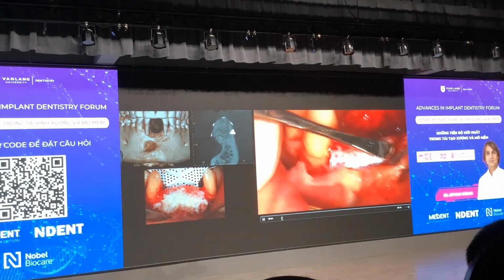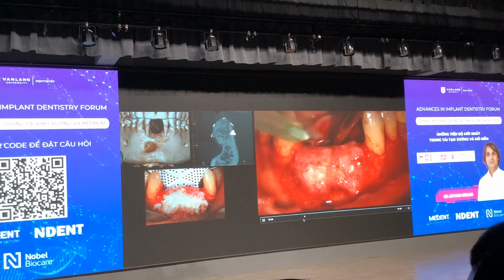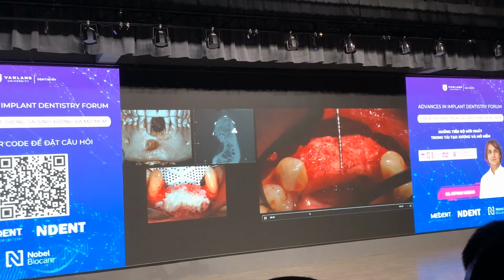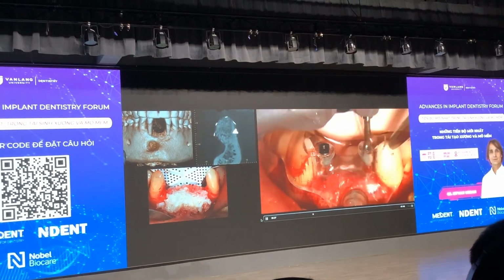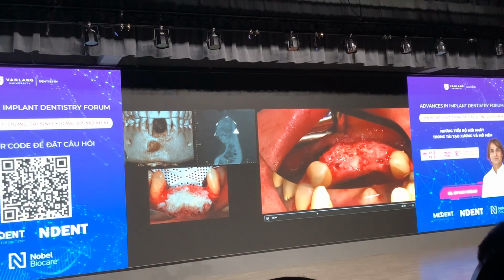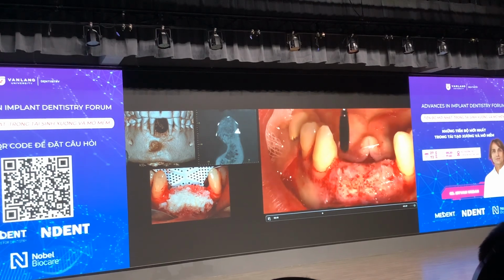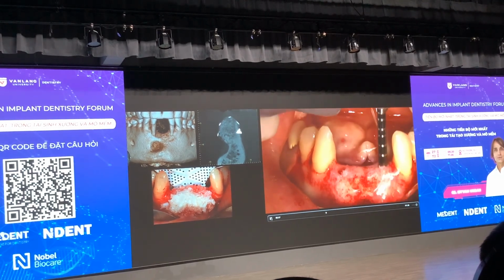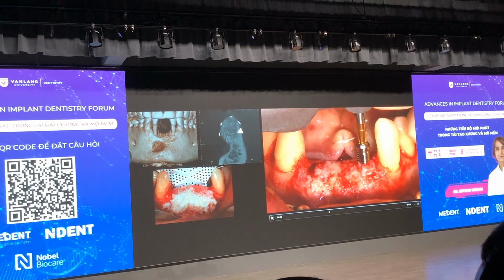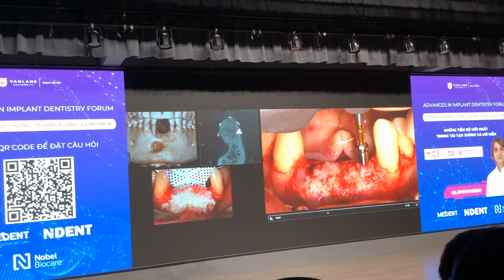Okay, so look. I'm removing this membrane. What is interesting here is that that's like a Noble surgical guide. And look, maybe you have never seen an implant like this. This is the classic Brånemark implant. Okay? Machined, very good implant, but it's outdated today.